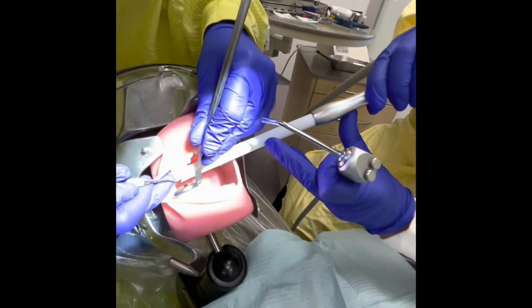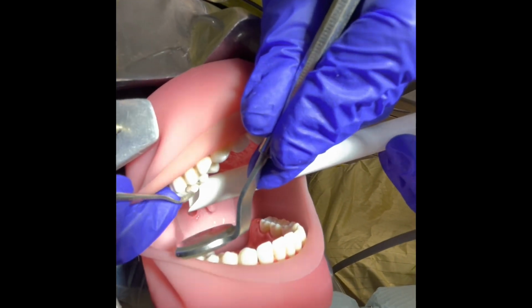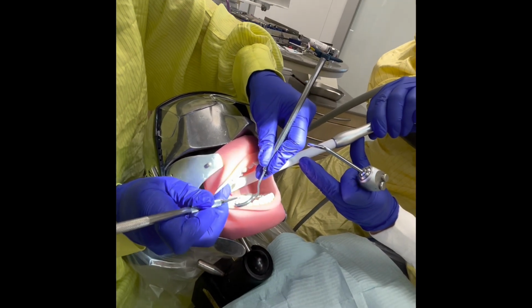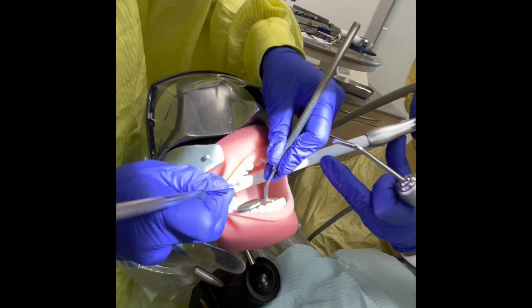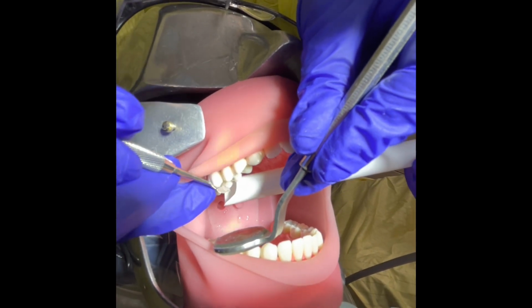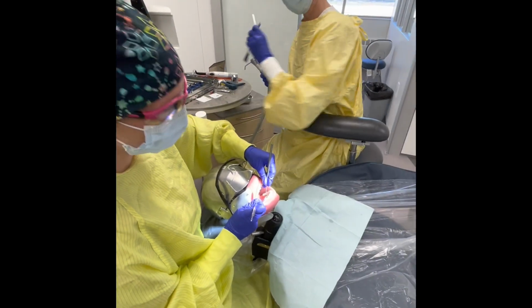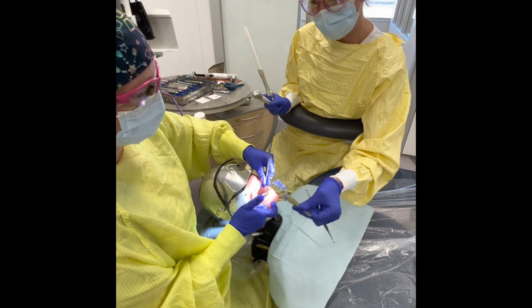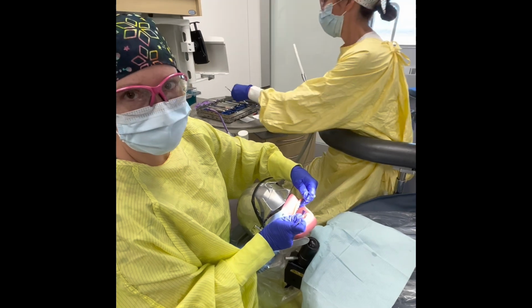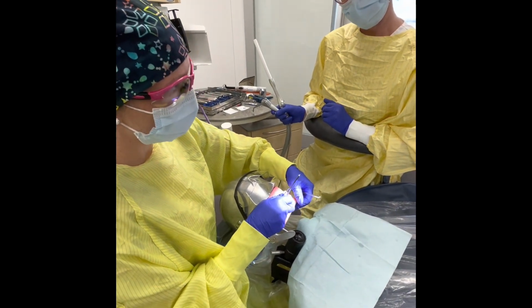This is very important, as you don't want the little bits of amalgam falling into the client's throat, okay? What your operator may do is take these little bits that are on the instrument and push them into your suction. That is okay. Some do, some don't. Okay, Stacy, I'm ready to check that bite again, please. As that tooth has already been dried, we haven't contaminated it again, so we don't need to dry again. Check the occlusion here.